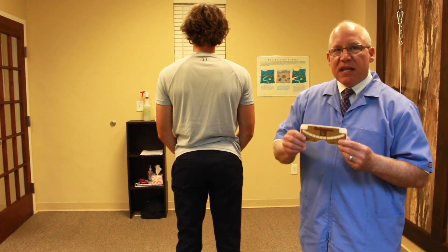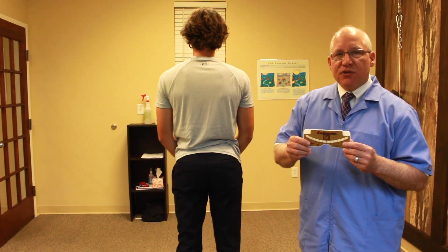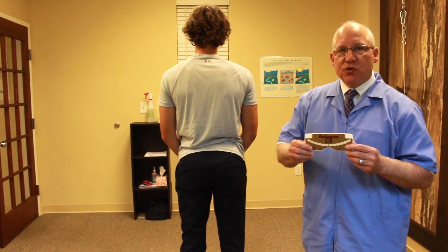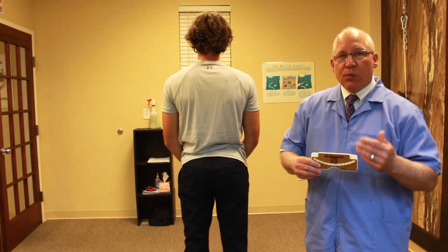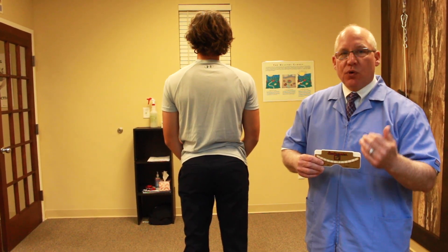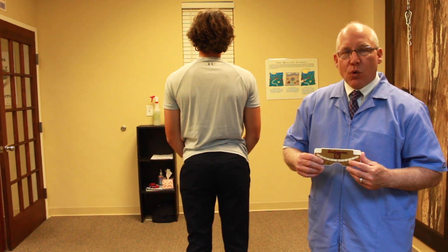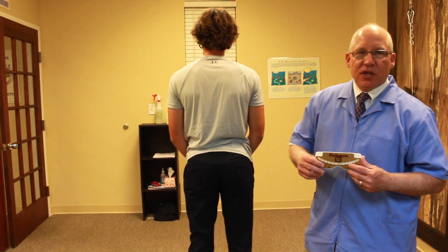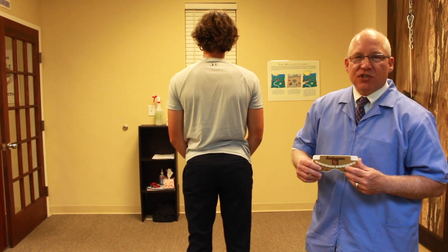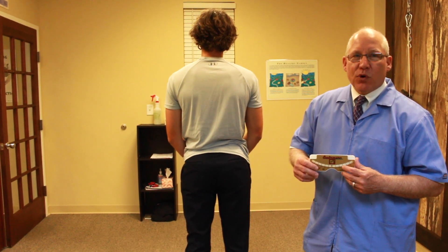Many of the chiropractors and doctors that we work with throughout the country have these, and it allows us to communicate back and forth — does the patient have scoliosis, or is the curve getting better or worse? We'll have more YouTube videos on this. This is Hartley Chiropractic and Scoliosis Center, Dr. Jay Hartley in St. Augustine, Florida. Have a great day.